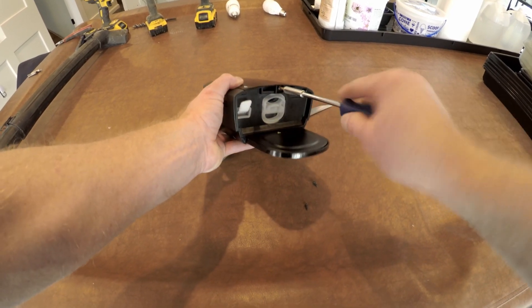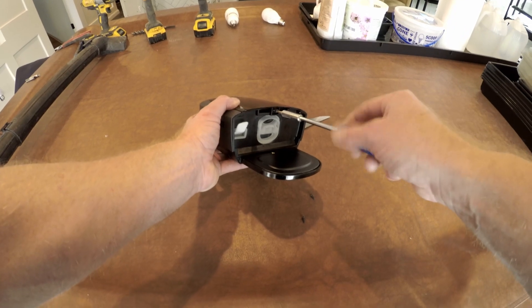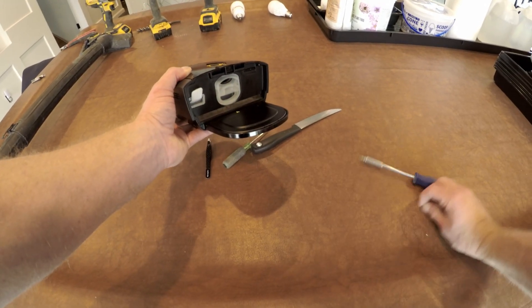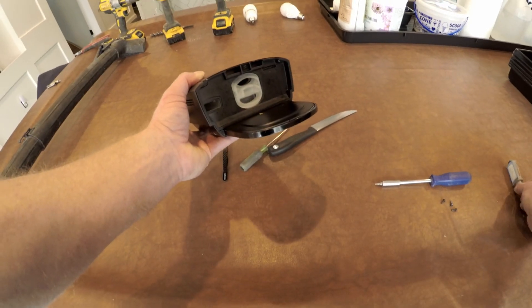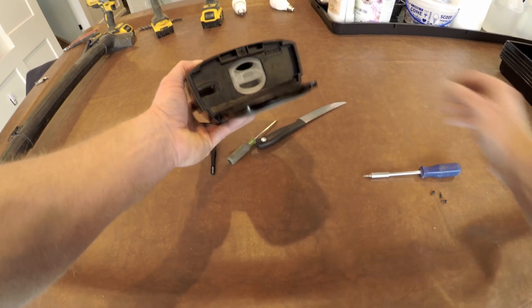Then there's one more screw just above the air intake, a little Torx screw that comes out. Then the next thing is to pop this top panel off. We'll set the air filter aside.